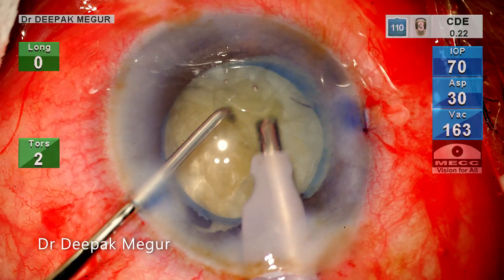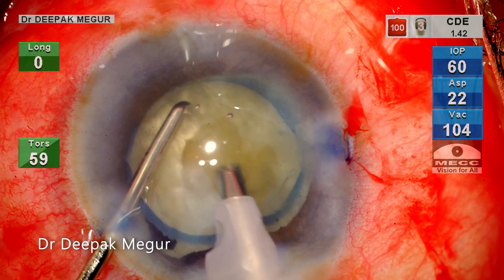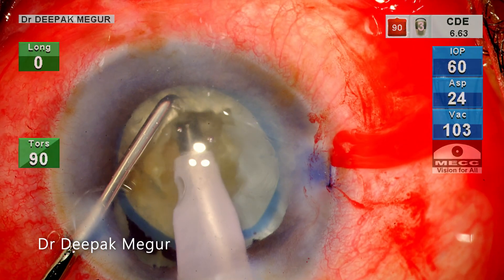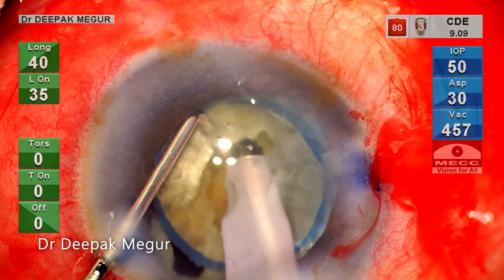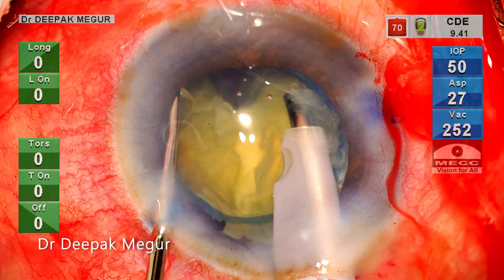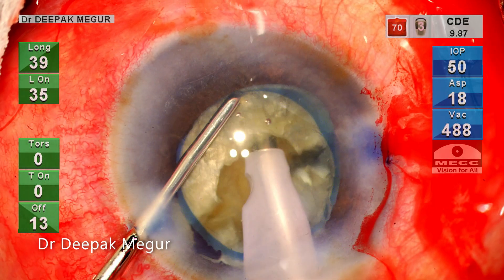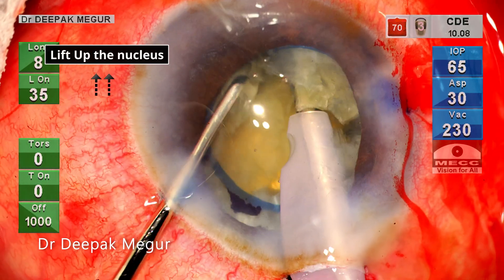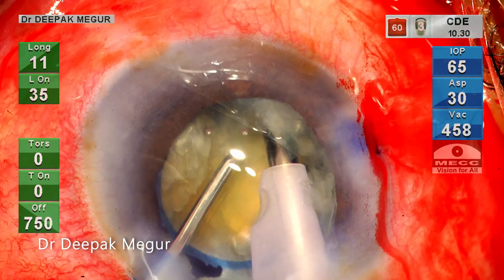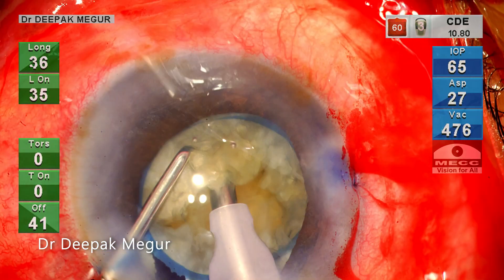I feel that the nucleus is relatively quite dense. I create a small trench with a couple of strokes of phaco. The idea is to get a good grip on the core of the nucleus. I bury my phaco tip deep into the nucleus and a vertical chop is performed followed by lateral separation. While performing the chop, I make it a point to lift up the nucleus a little bit with the phaco tip itself so that during the chopping and lateral separation maneuvers, stress exerted on the posterior capsule and the bag is minimized.